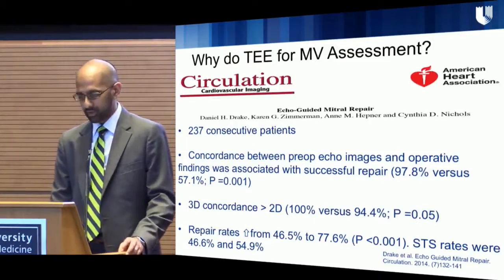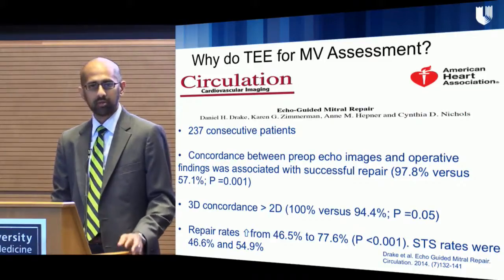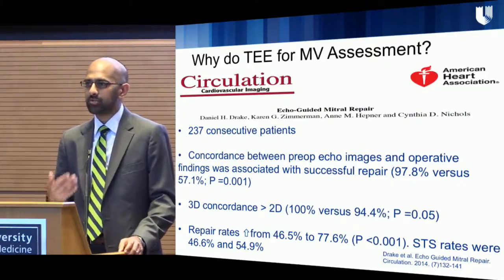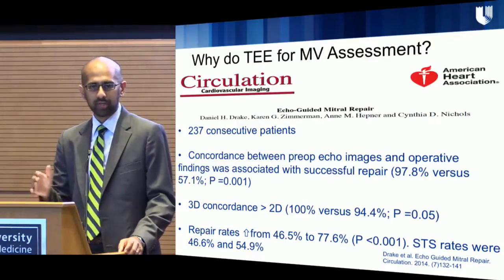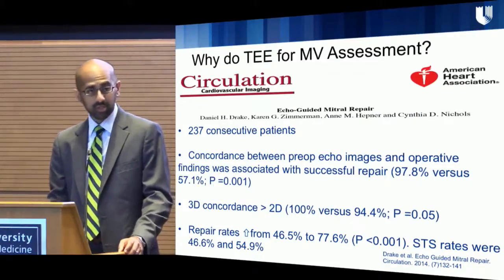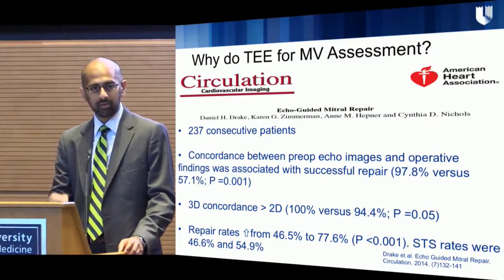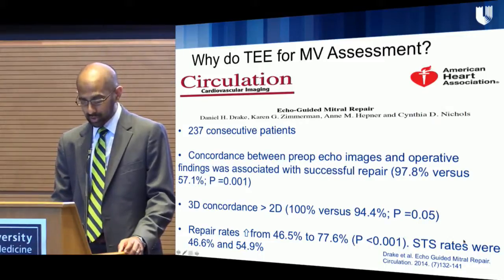Okay, so a little bit to the literature. This is a study that's a couple years old now, and is actually from the surgical literature. So there was a single center. They took 237 consecutive patients, and they instituted a protocol that started with 2D imaging, and then as 3D imaging became more available, went to 3D imaging. All of their patients got this protocol pre-mitral valve surgery, and they looked at their findings over time and how well they did. So there was a concordance between the accuracy of your pre-procedural imaging and your outcomes, okay? And that concordance was actually greater for 3D imaging than it was for 2D imaging.